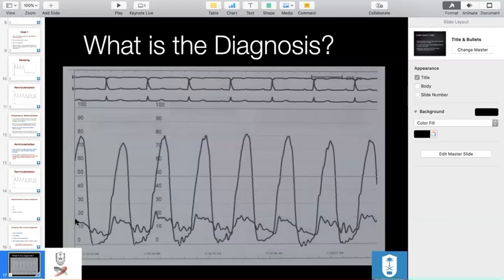So let's start with this small one. You can tell from the numbers that they are very low, because it's this or this. So it's very likely going to be right-sided. It's not always, but let's assume that's the case. It's a right-sided chamber for both of them. Here, you want to look at how it behaves in diastole. So here at the end of the T wave, this is where diastole starts, and here's the QRS. So diastole is from here to here, okay? So how does this waveform look here? It's not downsloping.